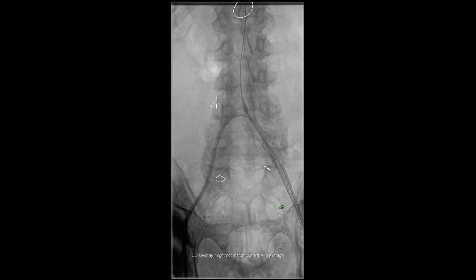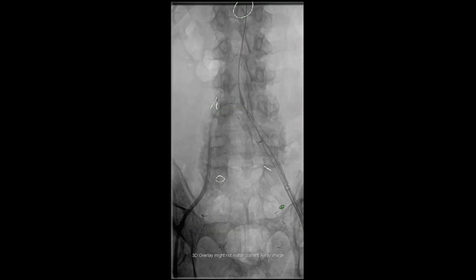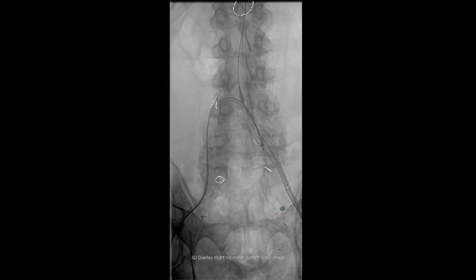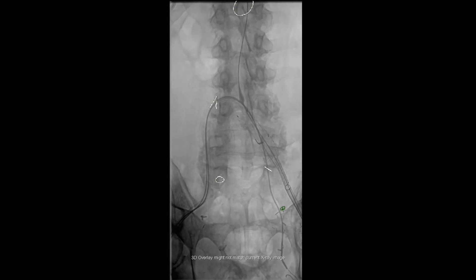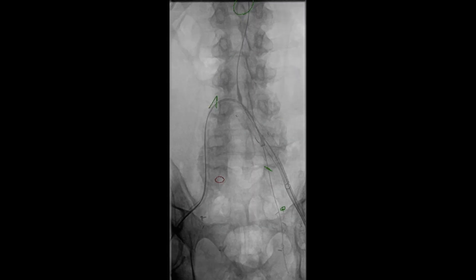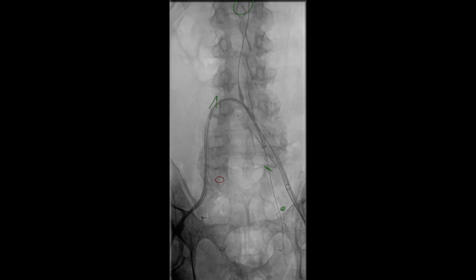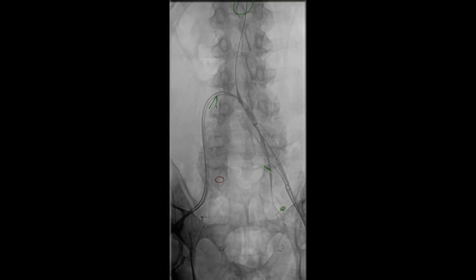We then proceeded with cannulation of the left internal iliac artery for our iliac branch device system. A curved catheter and soft-angle glide wire were then used for cannulation of the left internal iliac artery. Once the internal iliac artery is cannulated, a stent graft is then brought into place and positioned in the internal iliac artery.